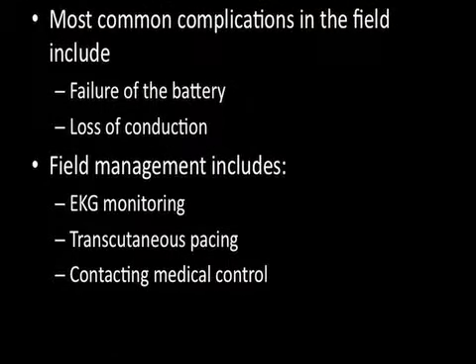And so that's a good opportunity there to see if there's something different that you should be looking at. The most common complications in the field include failure of the battery and loss of conduction. The field management includes EKG monitoring, possible transcutaneous pacing, and contacting medical control for future direction.